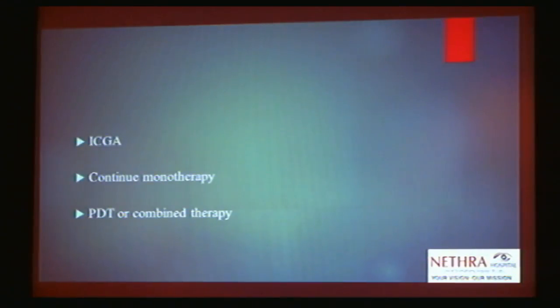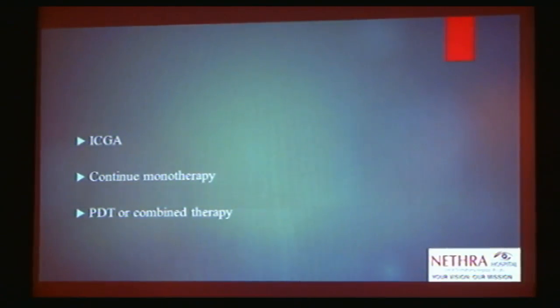So I would just want to ask, where should we stop, or where should we refer a patient for ICG in such cases? Because this is the common clinical scenario that we see. On FA we do see a CNVM, but when do we ask for an ICG? Because the patient has responded to our treatment but has not responded completely.